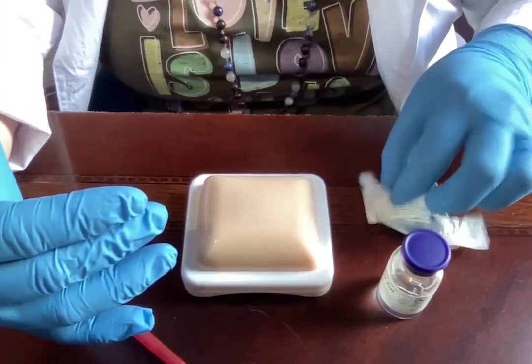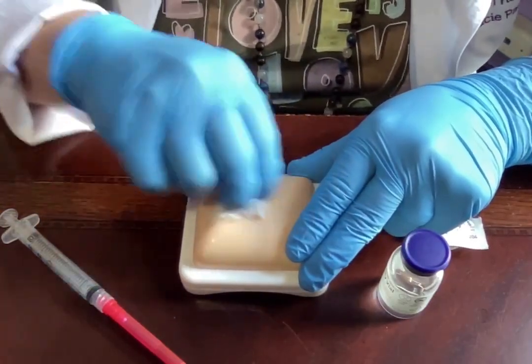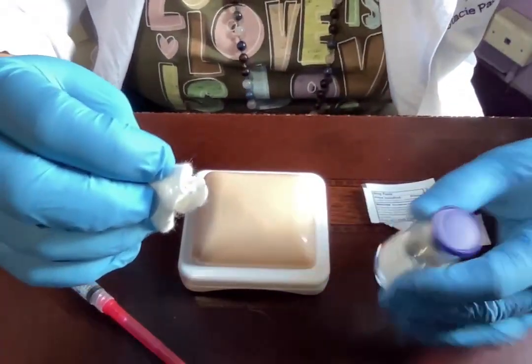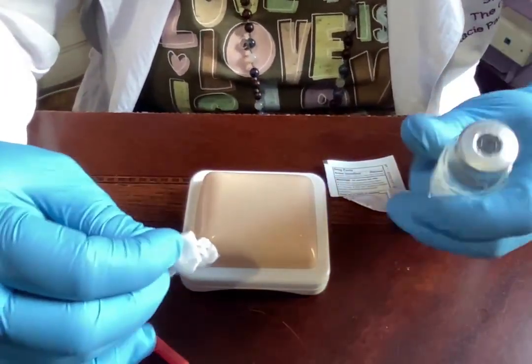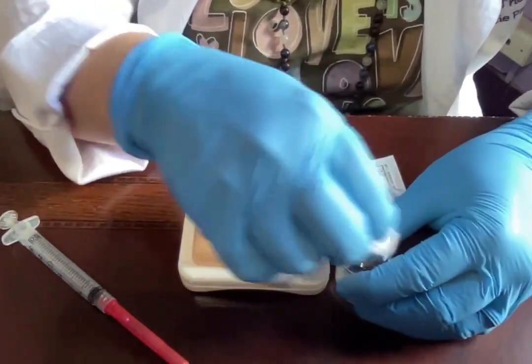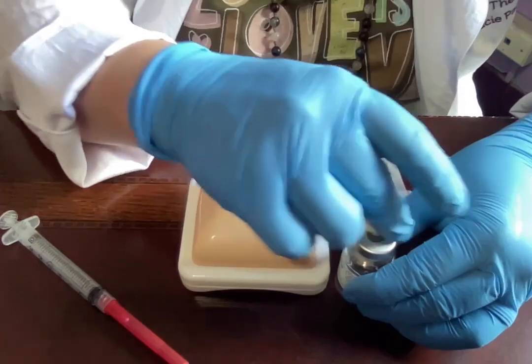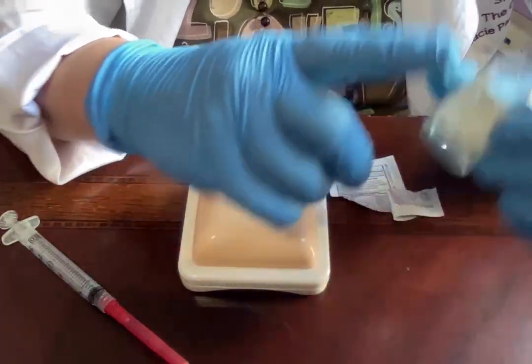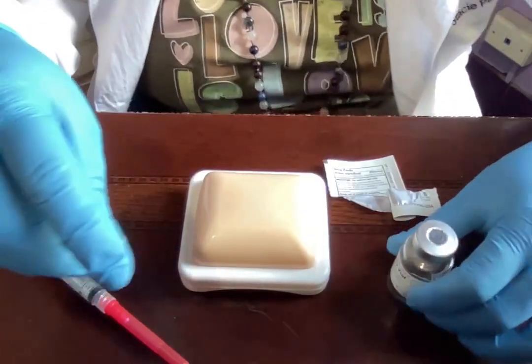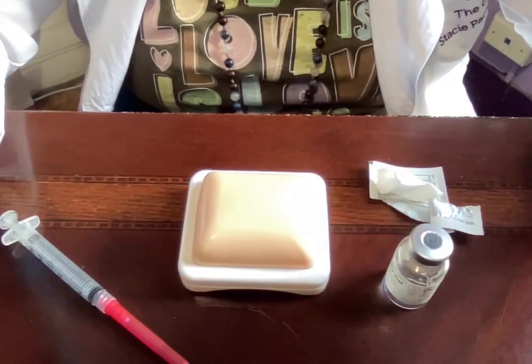Take your alcohol pad and in a circular motion for about 10 seconds cleanse the spot where you're going to inject. Then remove the cap — this is considered sterile. Also spend 10 seconds scrubbing the hub of the syringe. We want to make sure no bacteria can get into our supplies. Set the alcohol pad aside because it may come in handy later.